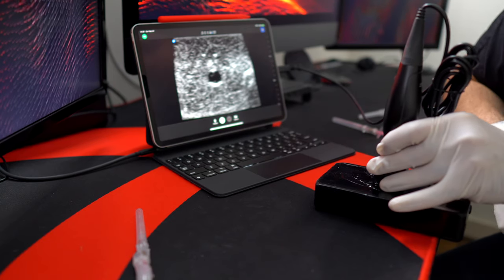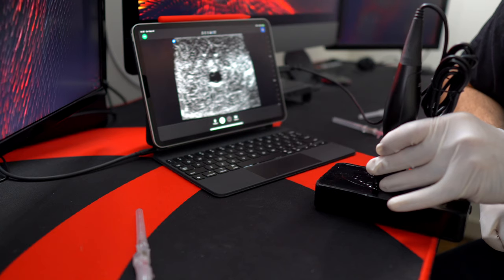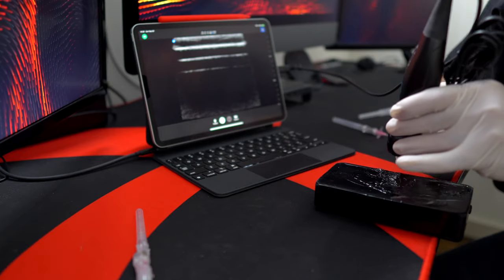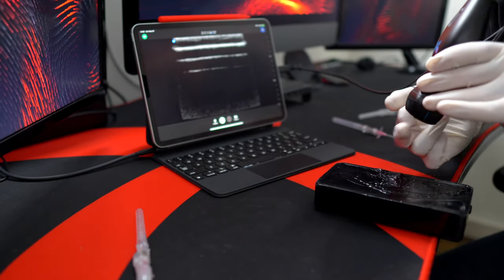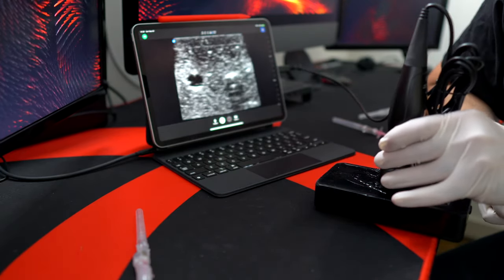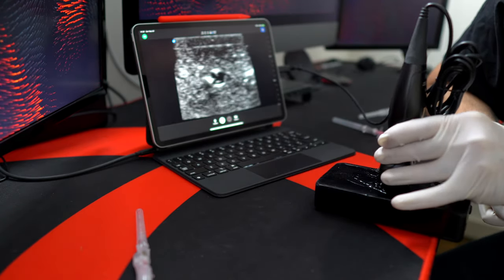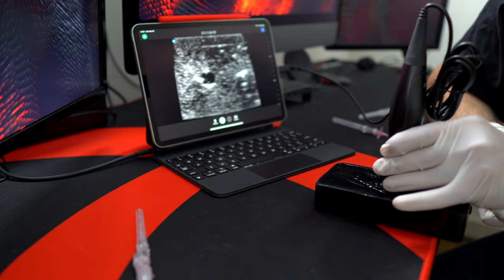This is a pretty good shot. Next I want to establish laterality — which way is right on the screen and which way is left. Some people pick up the probe and touch it to figure that out. I just roll half the probe off the screen — lift one half, then the other — and now I know right is right and left is left.